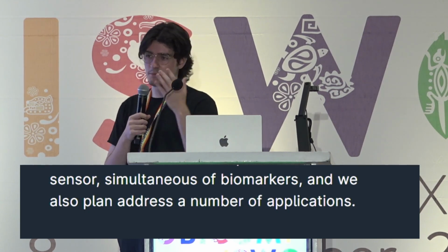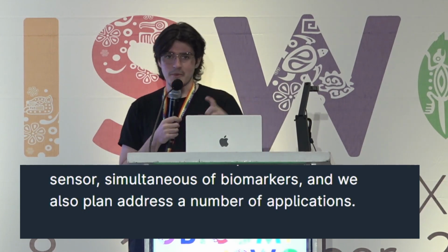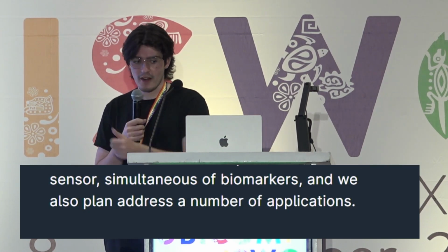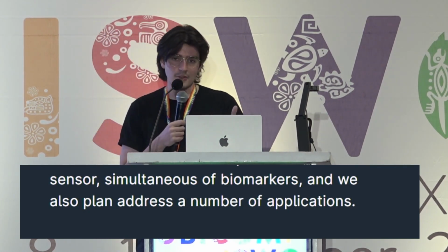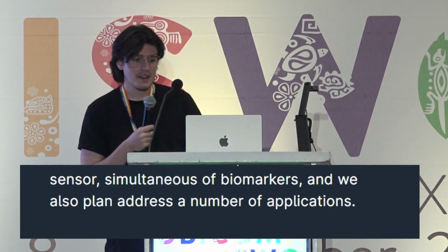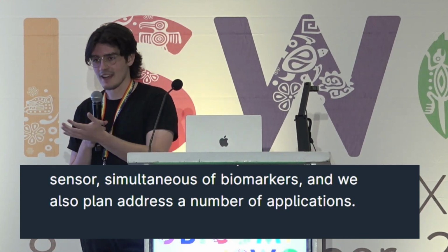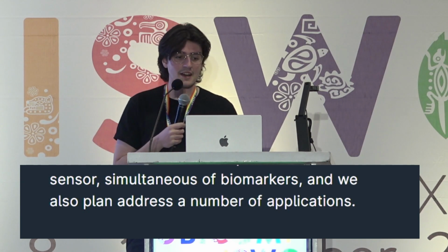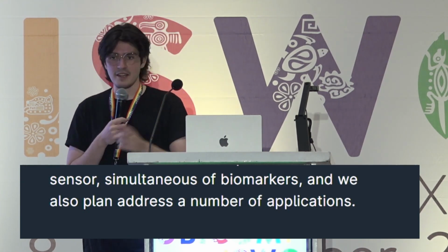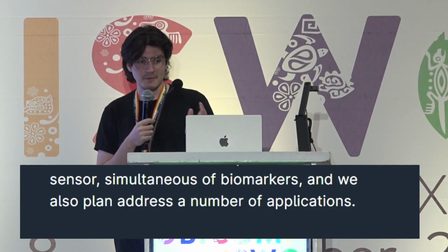The smartphone that's being brought in contact with the user has a touch sensor built in, obviously, and it's a capacitive sensor matrix that gives you a map of what's touching it and where on the device. And so if you put your thumb against a smartphone screen, what you'll see is a blob of capacitance roughly the size and shape of your thumb. And if you bring your forehead in contact with the smartphone screen, you'll see a blob roughly the size and shape of the contact between the phone and your forehead. And we expect that an increased contact area will also increase the heat exchange from the user's body to the smartphone. And so our full system looks something like this.